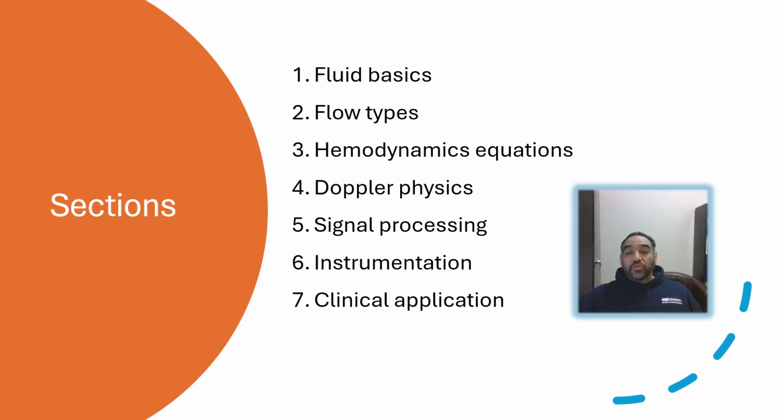Then we examined signal processing, where those frequency shifts were converted into spectral waveforms. And then after that, we covered instrumentation, learning how the system controls, like the PRF, the wall filters, the sample volume, and the angle correction influence what we detect and measure. So today, we transition into clinical application. So if the previous phases built the science and mechanics of Doppler, clinical application brings it all together.